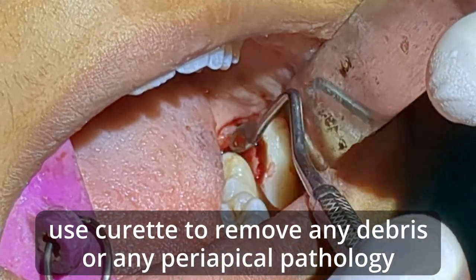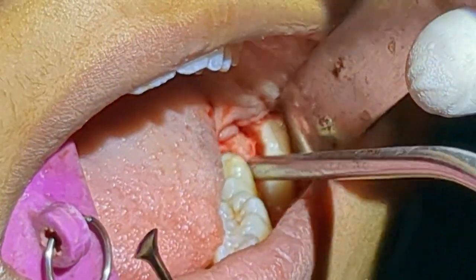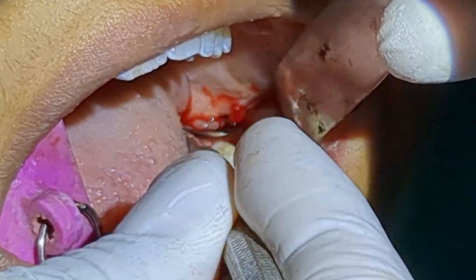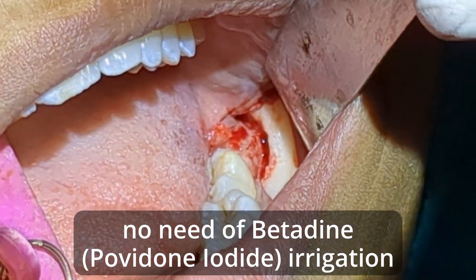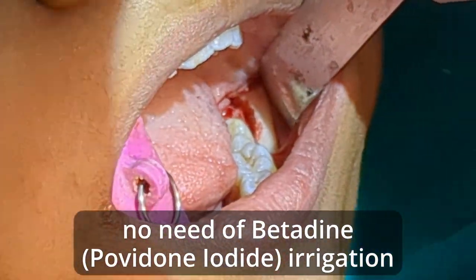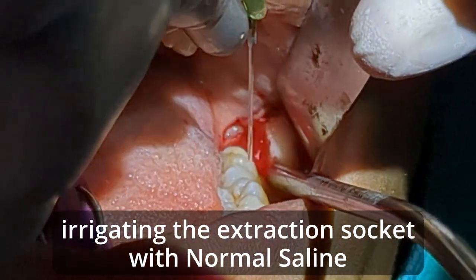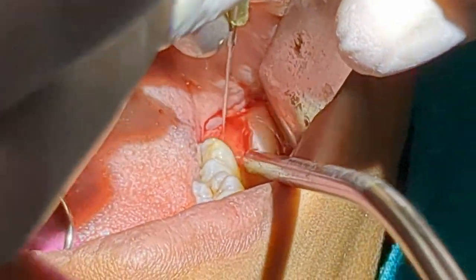One important step is to check if there's any periapical granuloma or anything. The radiograph didn't show anything, but to be on the safe side I'll be curating out just to see if there's any debris inside. There's no debris inside. Since there was no periapical infection — the patient had a little bit of pericoronitis — I don't have to use betadine irrigation. I'll just irrigate the socket with saline, and as always the irrigation should be of enough pressure that any debris inside will come out.